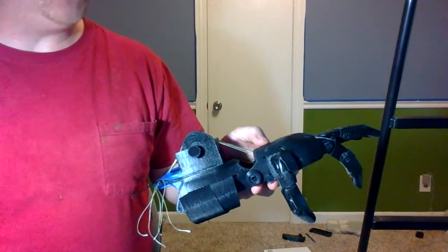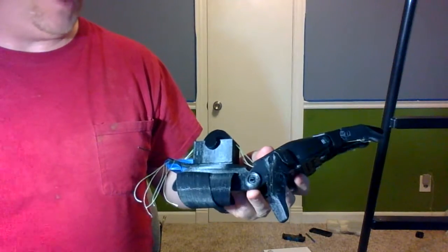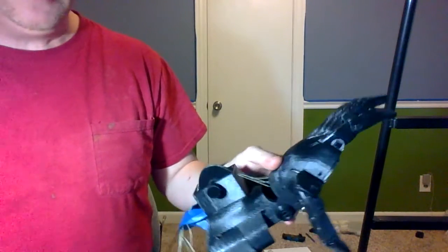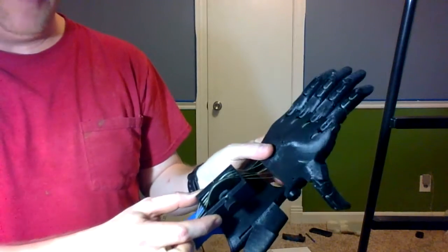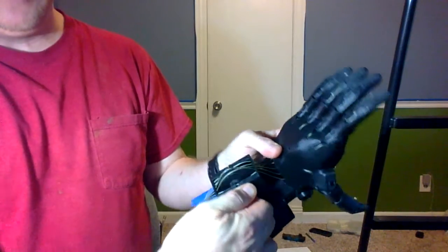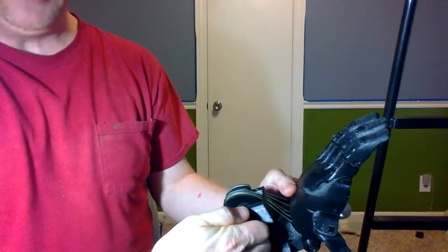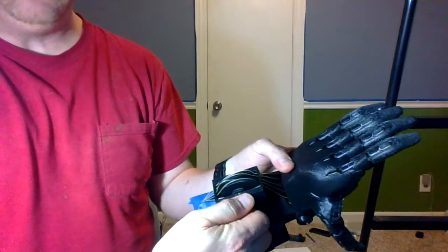I would like to show everyone a quick demonstration of a concept I've come up with to allow variable grip gestures with our hands. I've installed a little cam on the back of this hand that will rotate, and as it rotates, it puts different pressure on different strings to allow for different gestures.